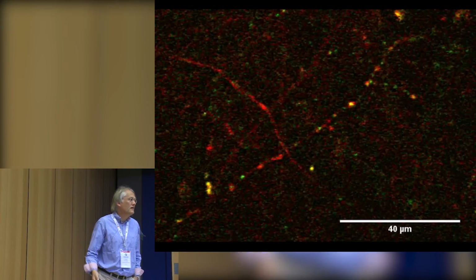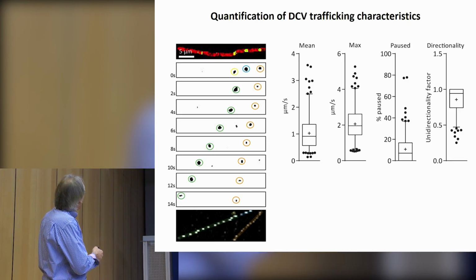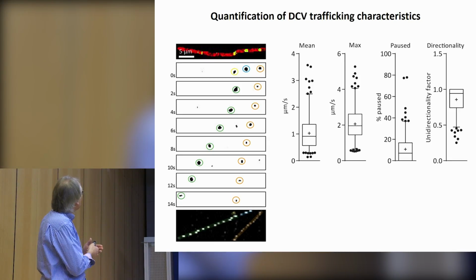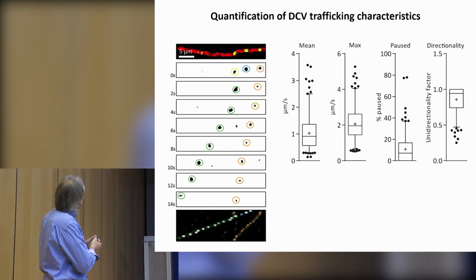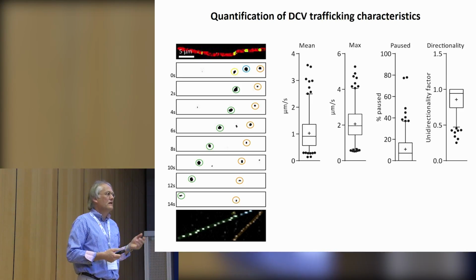So this is the data that we obtained and that we now analyzed by doing these typical kymographs. This is a so-called kymograph down here. So what we show here is this is a stretch of axon that we imaged. So the transport in this case goes from right to left. There are 3 vesicles at time point 0 that are circled here with different colors. And now if you look at this one here, you can see that for 2 seconds, 4, and so on, as time progresses, it moves a little bit, a little distance. So distance is basically in x and time is here in y. And so you can then see, according to this trace here, that shows you the trafficking kinetics of that vesicle.